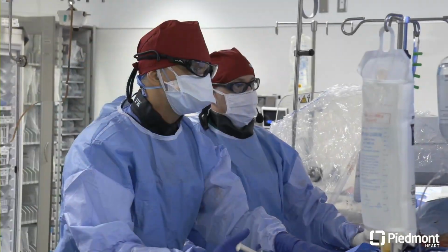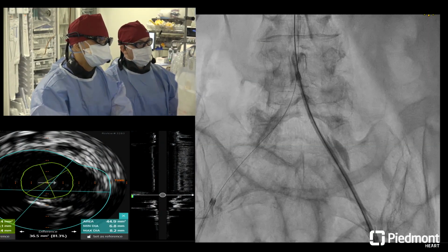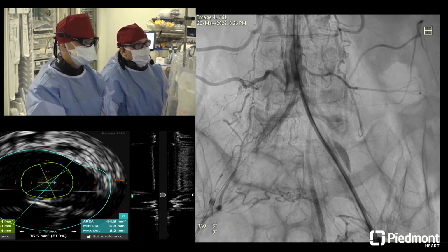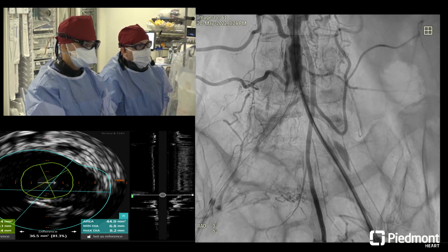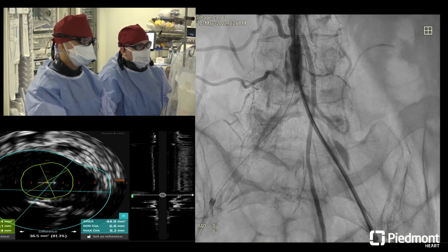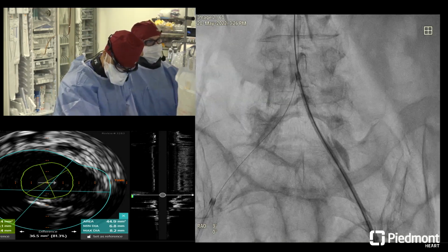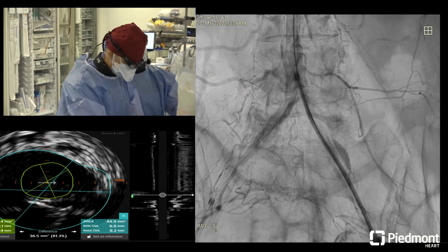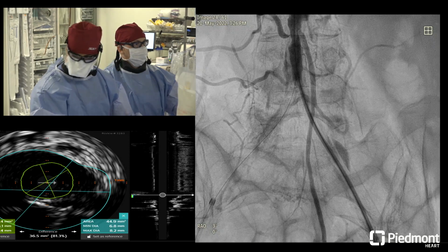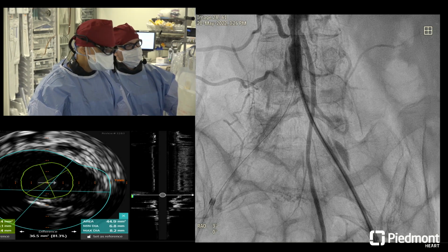I think this case brings up a really interesting discussion around when we bring people for complex iliac procedures: we need to consider what's going on in the aorta as well. Because a coincident aortic aneurysm means we should really think about an EVAR, and certain surgeons will recommend intervening on that earlier. This does not look particularly aneurysmal, but I wonder about anyone's thoughts. If there was an aneurysm here, I'm having trouble with the landing zones for the limbs in the iliacs. What do you guys think with an isolated EVAR strategy? Also, access. There's one product that gets as low as 12 French.